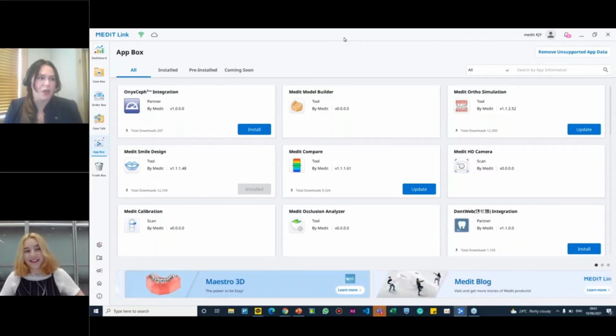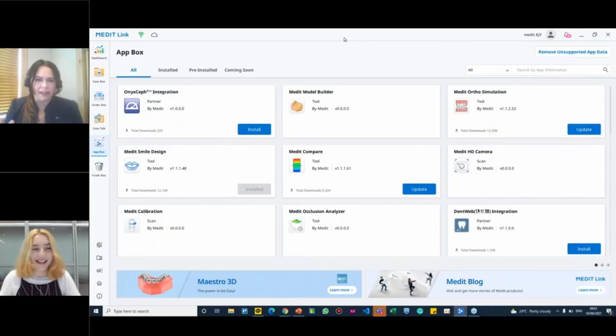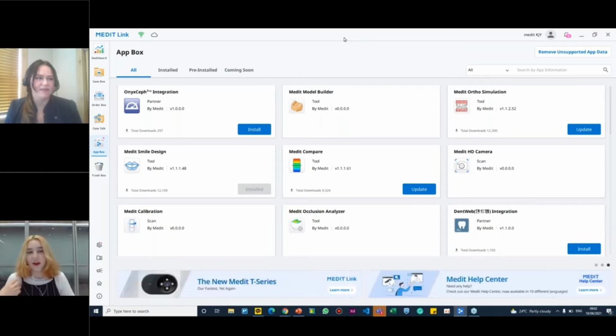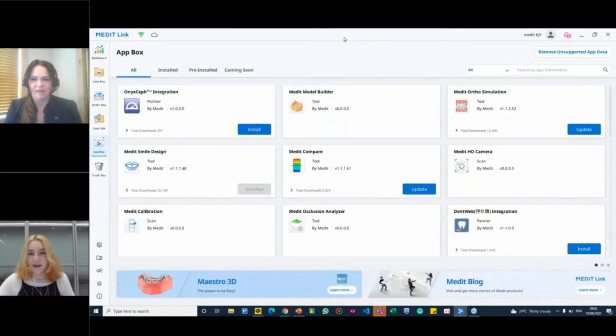Okay, and I know Smile Design has kind of been your baby, I guess. Yes, so I oversee apps in general, all of them, but as a product manager, I specifically deal with Medit Smile Design, and I plan it together with my product team and develop it all together.